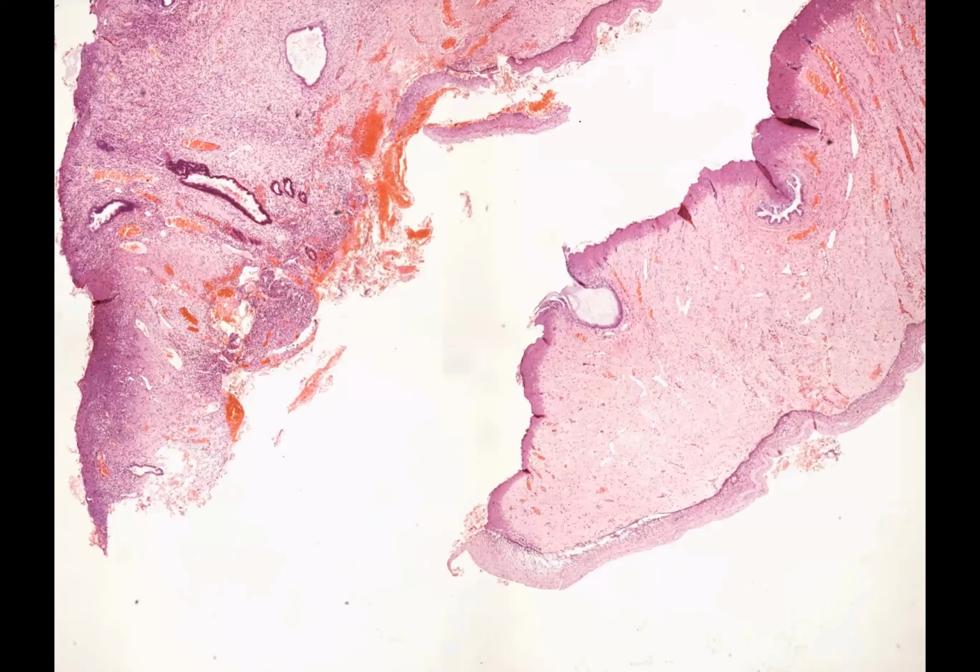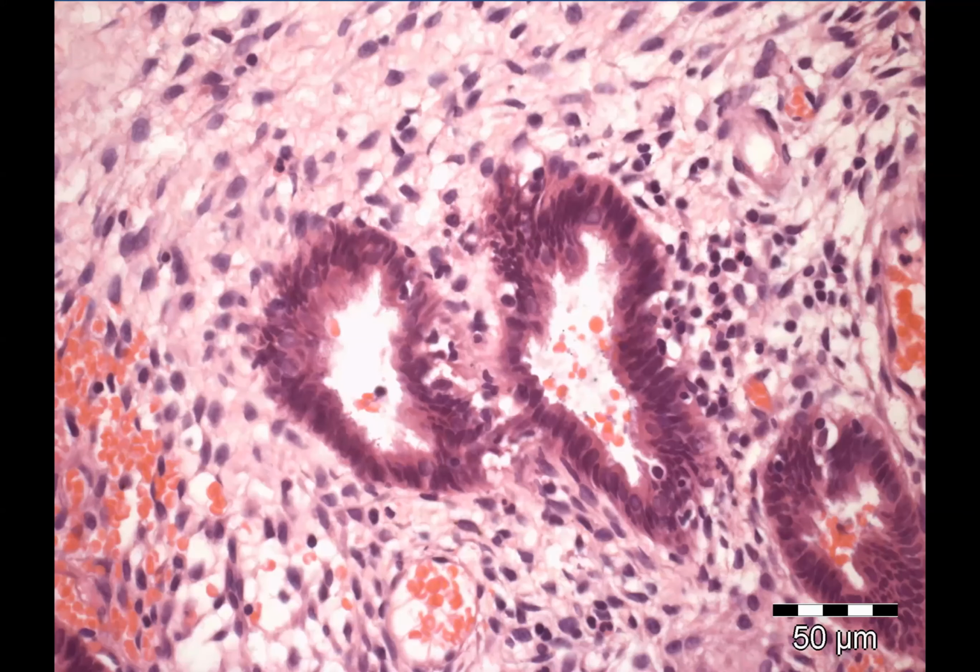The patient was discussed at MDT and ultimately went on to have a cone, and this is at low power. So you can see we are in the transformation zone. We've got an endocervical crypt here with surface squamous epithelium, but you can see on these two pieces my eye is drawn over to this. It looks much darker, and usually when endocervical groups look darker, it's because there's an increased NC ratio and something's going on there. And on a higher power, this was our tubo-endometrioid metaplasia. You can just about see some cilia here. And that correlated nicely with what we had seen on the cytology specimen preceding it.